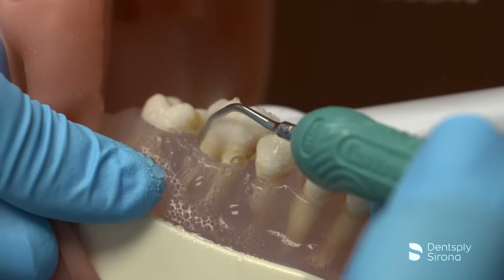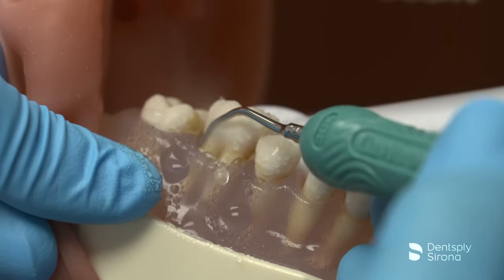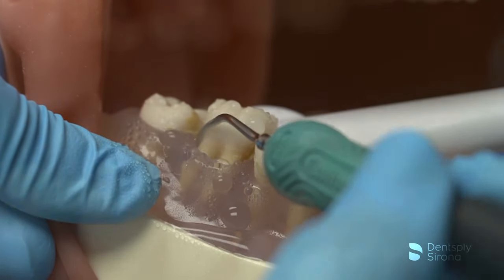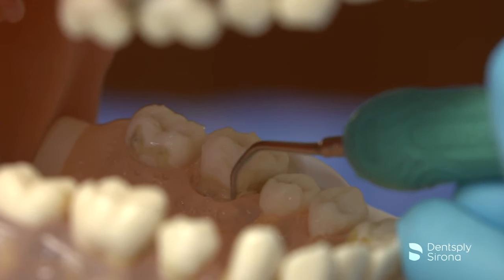The clinician will start by adapting the lateral surface on the clinical crown and uses the back and/or face of the insert tip as needed. Strokes may be performed in a horizontal, transverse, or vertical direction, as long as the clinician is methodical and covers every square millimeter.